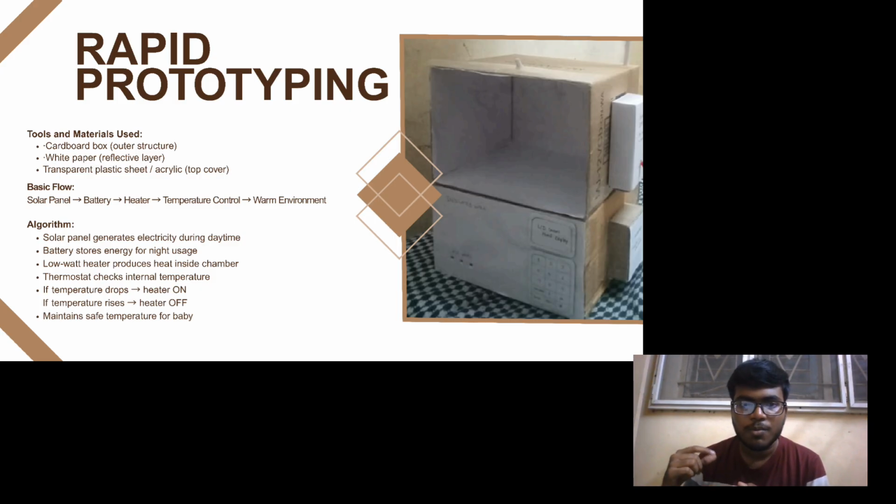And in the front we have a small control panel to control the temperature of our project. The control panel will be used to directly control the temperature of the baby as well as the insulation, and there is an air vent to control the inflow and outflow of the air. So that's our prototype. Thank you.